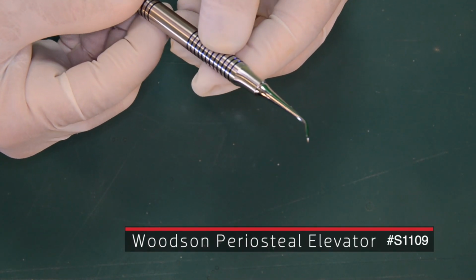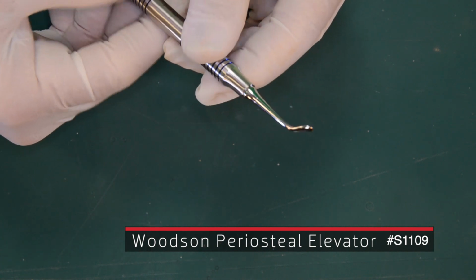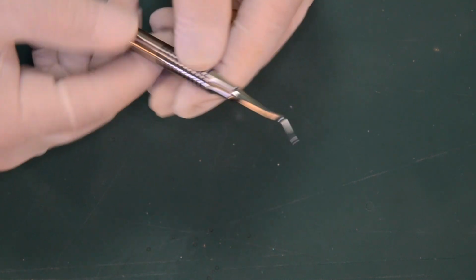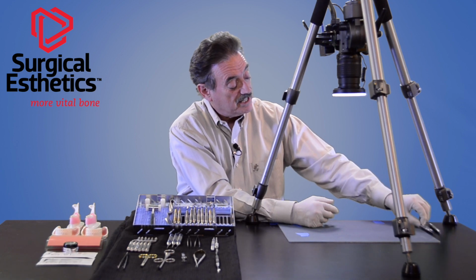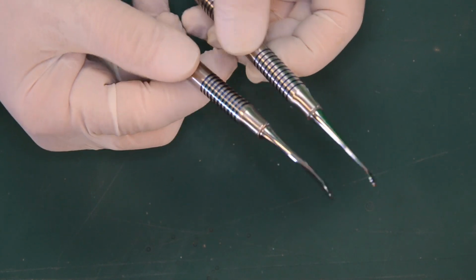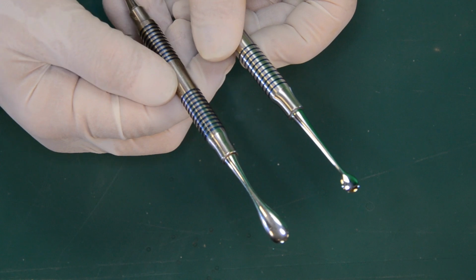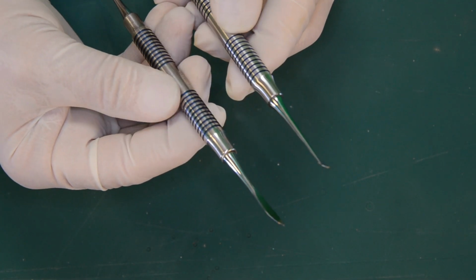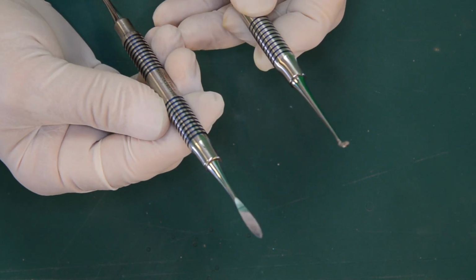The other instrument, which is similar to a Molt, is a Woodson. The Woodson can be used both as a microperiosteal elevator as well. This side is very similar to the Molt, and the other side is similar to the microperiosteal elevator. You can compare the thicknesses of these instruments to a traditional periosteal elevator, and you can see how thick traditional periosteal elevator is, looking at both sides, and how difficult it would be to especially raise a papilla with an instrument like this.